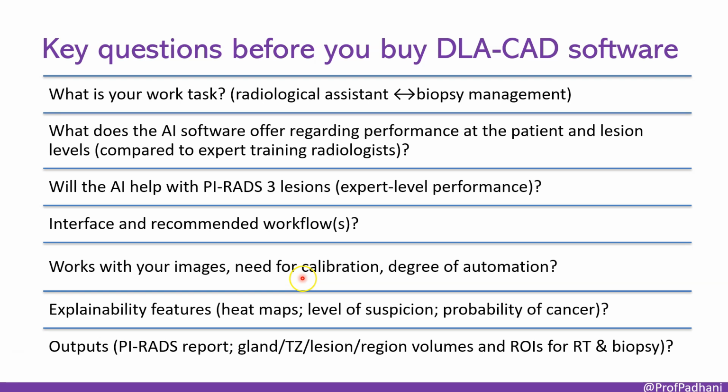What is the user interface like? And what workflows does the vendor recommend and support? Does it fit your workflow? Does it work with your specific MRI images? Or does it require calibration? What is the degree of automation? What explainability features are offered? Can you understand why the AI made a finding? And finally, what are the outputs? Does it generate PI-RADS reports? Does it provide accurate volumes, exportable ROIs suitable for RT and fusion biopsy systems?